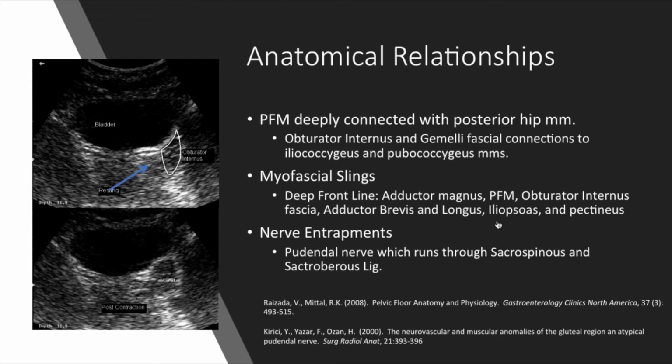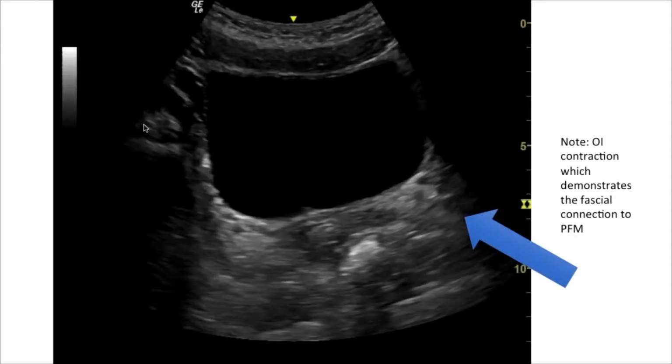And if you look over at the picture, looking at our bladder down here, this is actually an image of your obturator internus. And so you can assess, is there any restriction or connection between the pelvic floor's ability to contract, and is that obturator internus having any type of effect on the quality of your contraction.